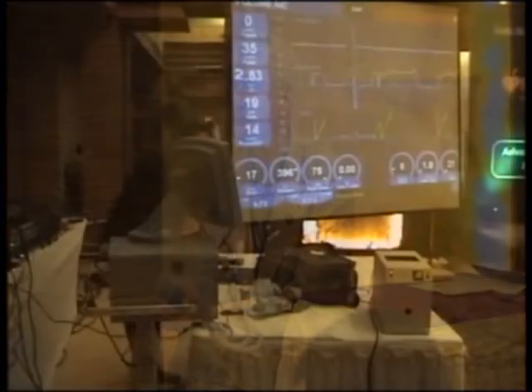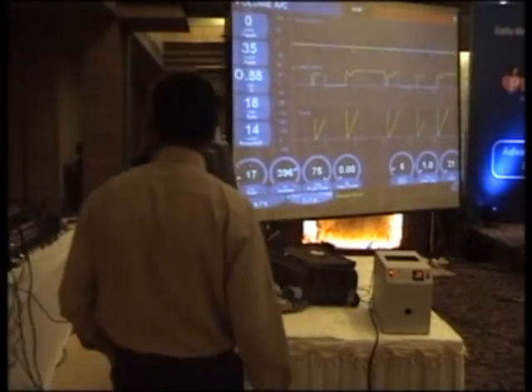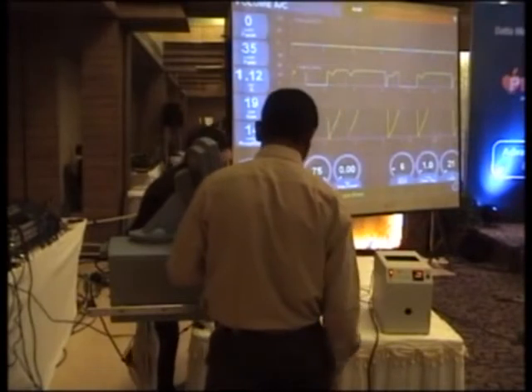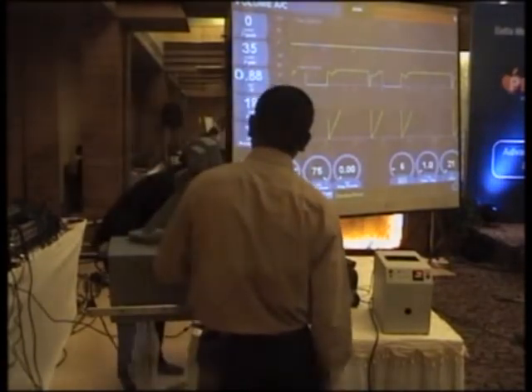Bear with me for one more second. For some reason, the ventilator doesn't like this, but it just takes a little bit of time. Sometimes when I make these big changes in compliance or resistance, it senses an error. So we'll get this running here in just a moment. So like Jerry was saying, this patient has been sedated and paralyzed for some time now, right?